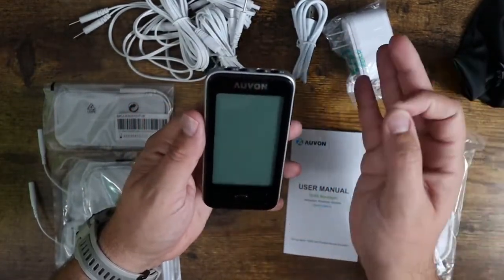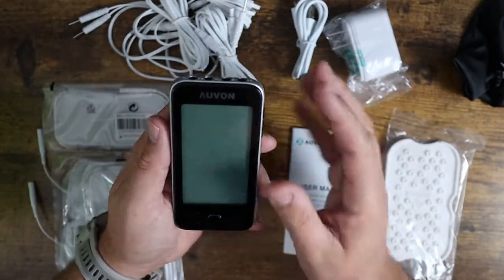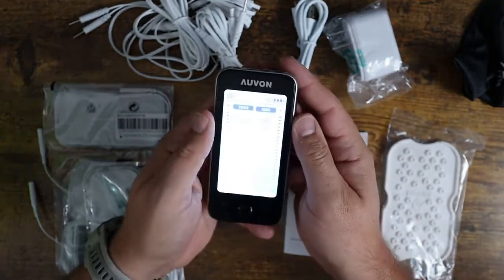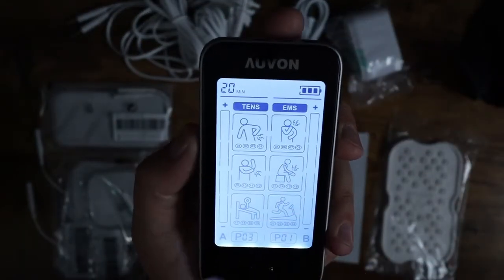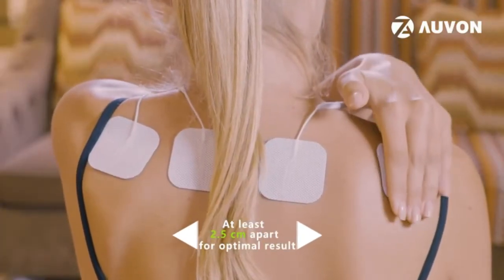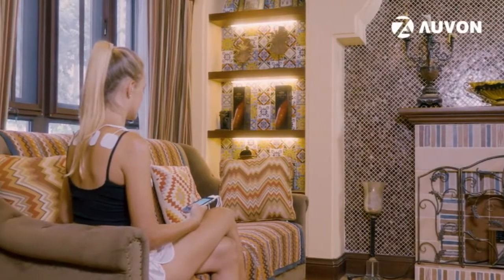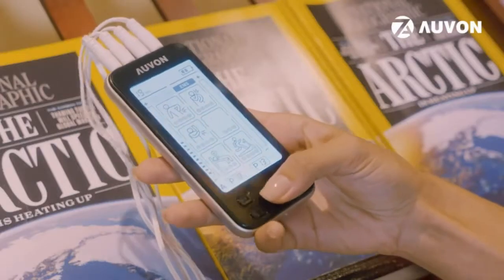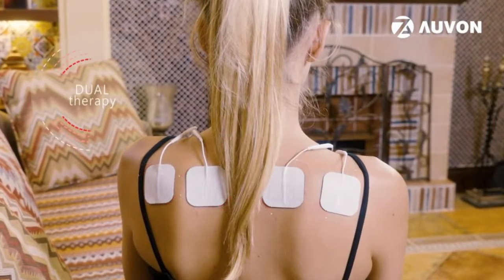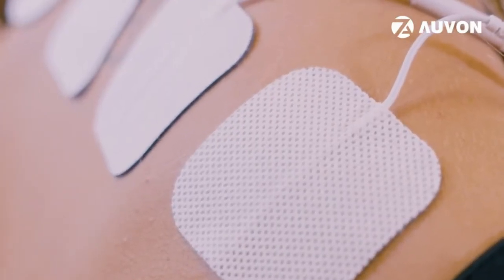Definitely recommend reading the instruction manual if you don't know how to use this. It's very simple and easy to use, and it's safe for the most part — you just want to make sure you're doing it right because it can be a little bit dangerous if you don't know what you're doing. Turning this on, you push and hold down the power button. You've got different settings for different uses: back pain, shoulder pain, elbow pain, knee pain, weightlifting, cardio pain — all sorts of different settings. You can adjust the power, the strength, the battery life, and the time. You can run it as TENS or as EMS. You can do A side and B side, so you can do different things on different sides — for example, using this on your shoulders and your knees at the same time. Lots of different combinations.